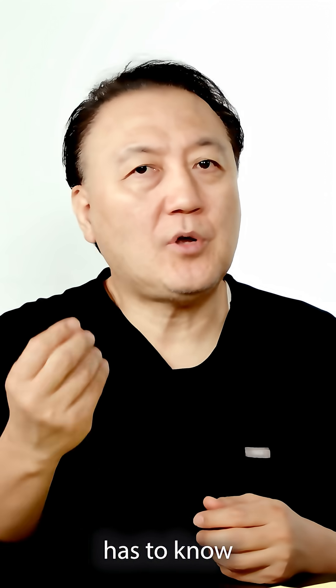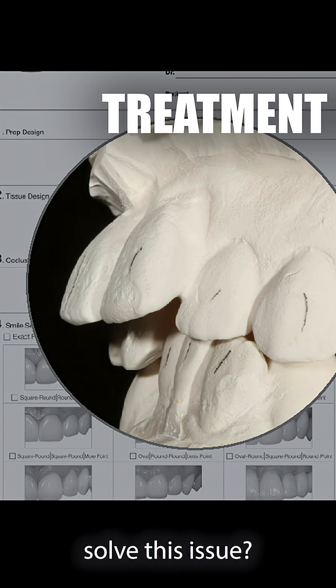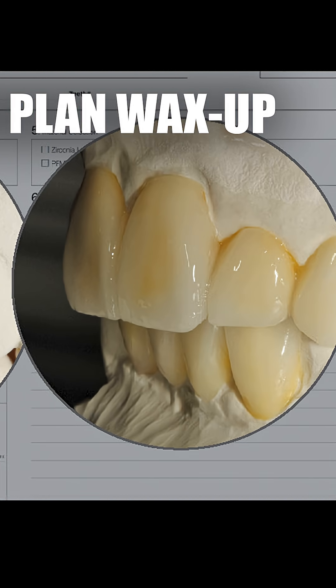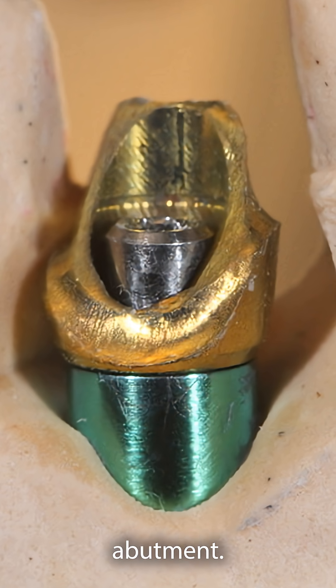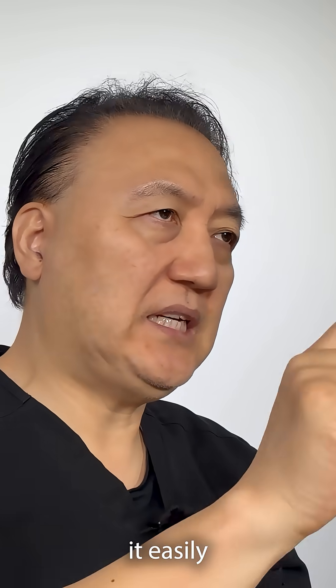Patients have to know: what is the cause, what is the problem, and how can we solve this issue? What I'm saying is we just let them know — no surprises. And we always make the custom abutment. No titanium base, because whenever you use a titanium base, you can easily fail.